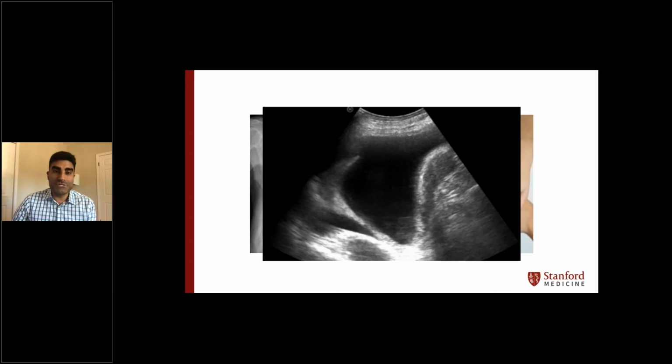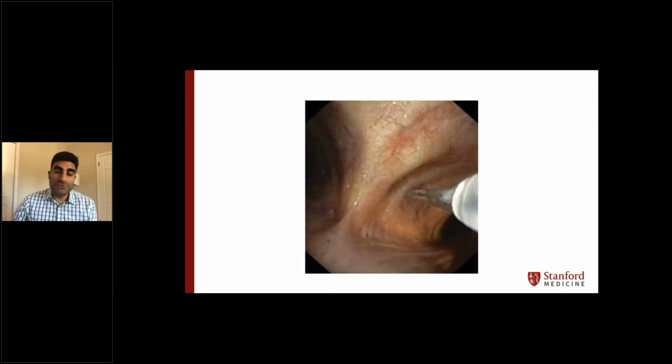Why? Because it gives us image guidance, it gives us confidence, it gives us feedback on the safety and the success of doing thoracentesis. Same thing comes with when we used to do lymph node biopsies. This is before my time, but there were quite a few practitioners that were doing basically blind transbronchial aspirations of lymph nodes.